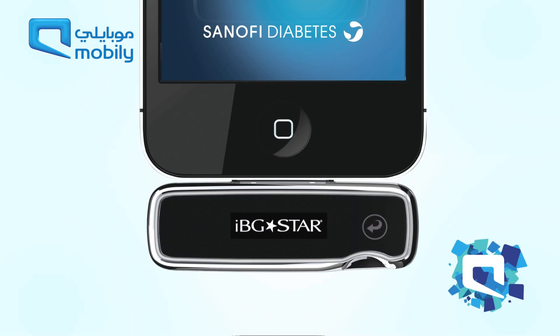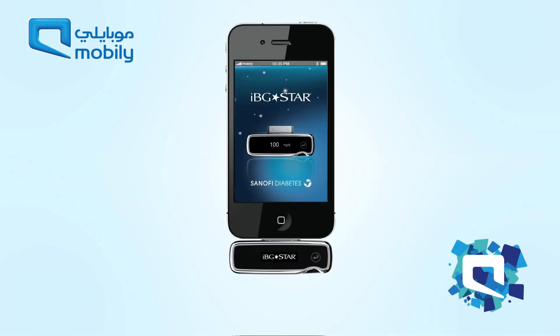To test blood glucose with the IBGSTAR, launch the IBGSTAR Diabetes Manager app on the iPhone or iPod Touch.